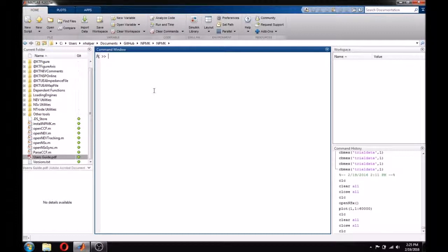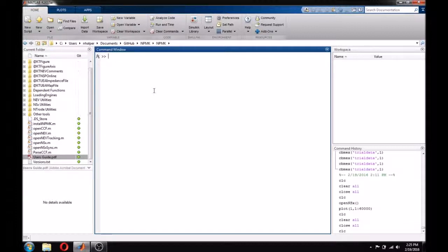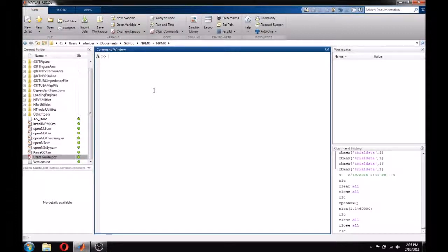As the name suggests, OpenNEV handles our NEV files, or neural event files, and OpenNSX handles our continuous data files, such as NS2s or NS5s. Since the NSX file format is a bit simpler, let's start with that one.